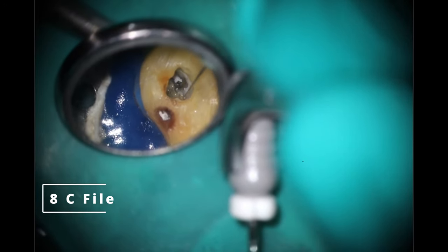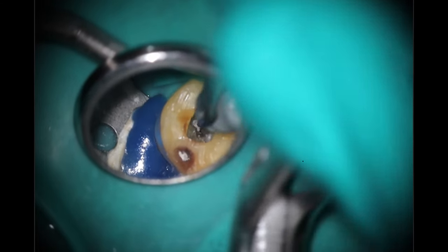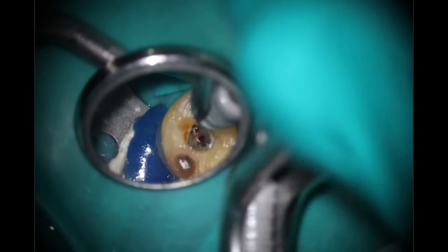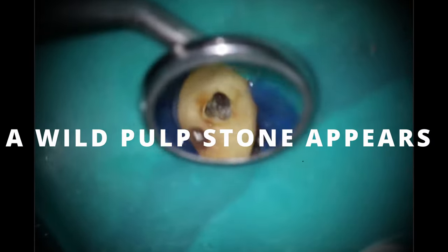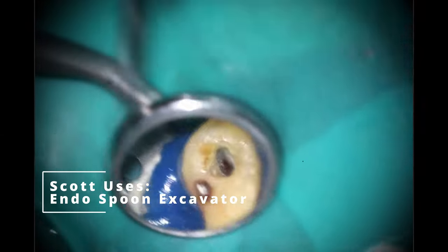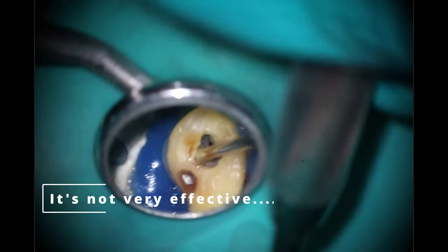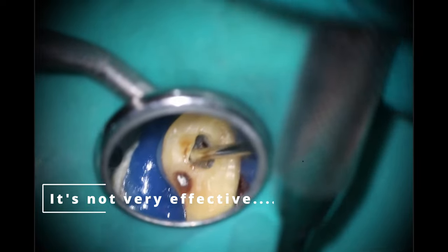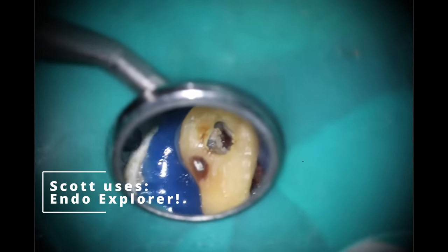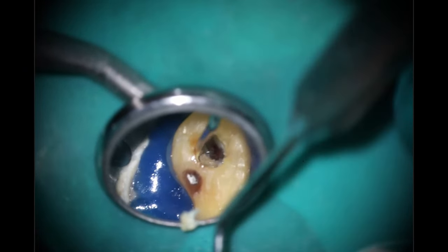There's something weird about this current batch that's coming through. So going in here with that 8C — great as far as the MB — still can't get good direct straight-line access. And the reason why is because of that pulp stone. So try to get it in there with a spoon excavator — it's one of the endo ones that's a little bit longer. Unfortunately, it's just not coming out of there. So switch over to my next option, which is an endo explorer — the nice part about that is you can kind of flick it a little bit more, break it into pieces.